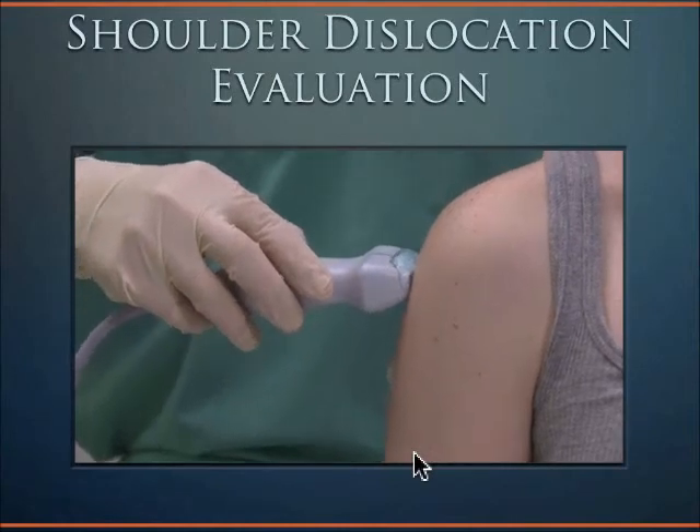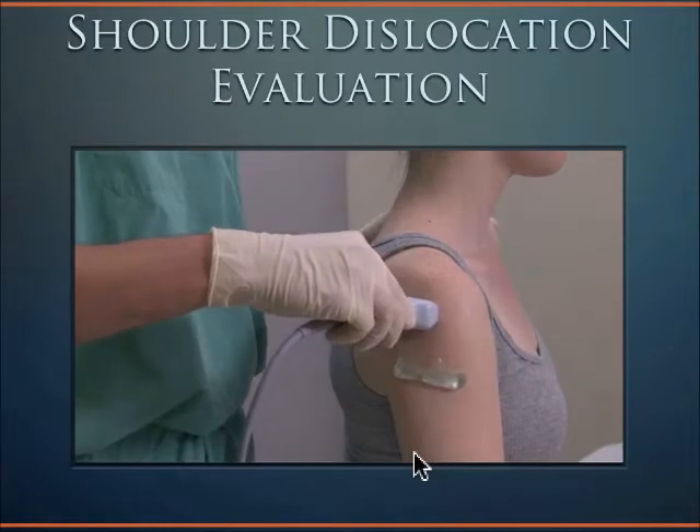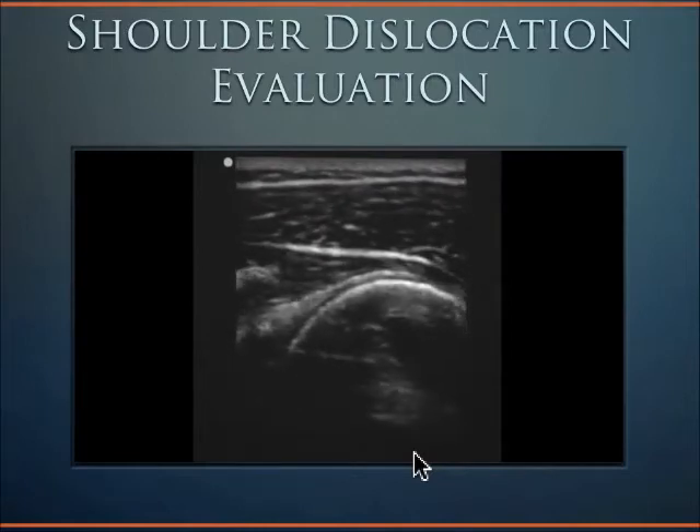The probe should be moved cephalad up along the humerus, keeping the humerus within view on the monitor. When you reach the superior aspect of the humerus, slide the probe posteriorly along the curved end of the humerus.